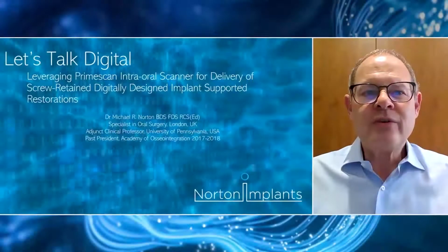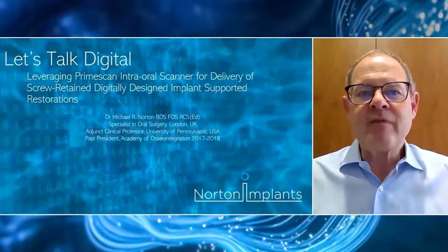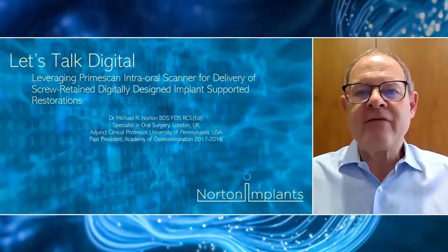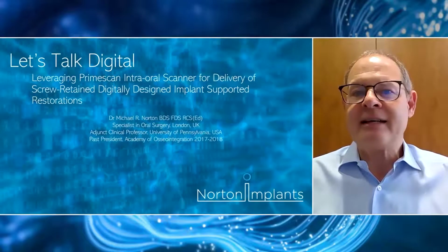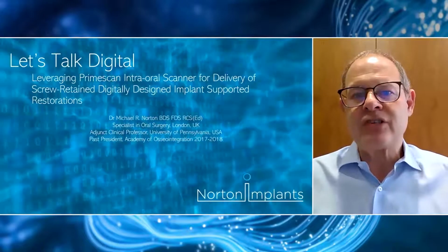I'm here to talk to you today about leveraging Primescan, the intraoral scanner, for delivery of screw-retained, digitally designed implant-supported restorations.